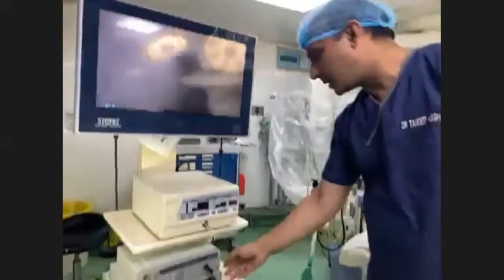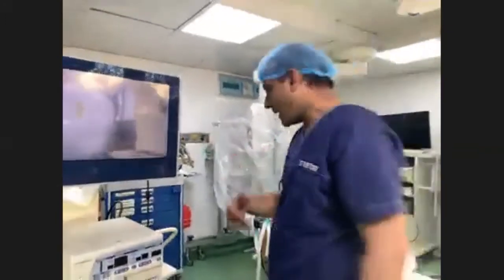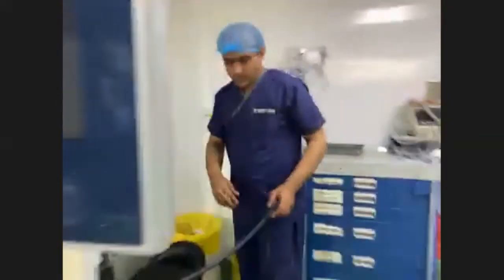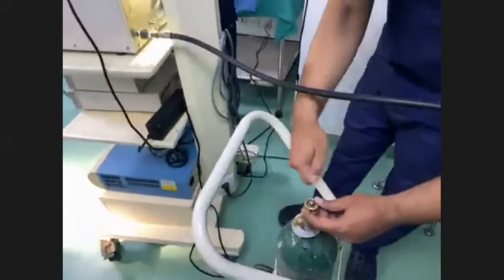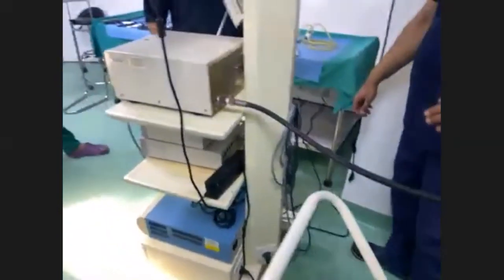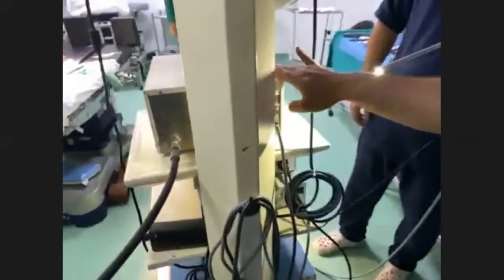But when you are starting it, there are some important things to do. If we go to the back of this tower, we can see that there is a cylinder which is attached to the insufflator. And you need a knob to open it and close it before and after the procedure. We have power supplies to all our equipment: the insufflator, camera head, and the CCU.